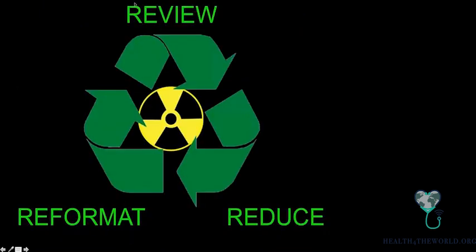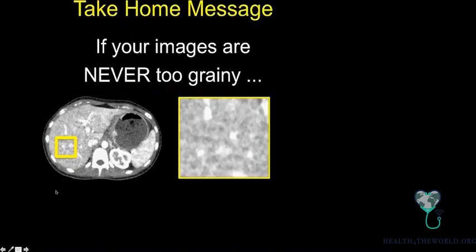Okay, so we've talked about understanding the dose, we've talked about lowering the dose, and then we've talked about taking low dose data and making it look better. The take-home message I will say again was, don't be afraid of seeing this. You kind of want to see a study that looks bad because you know you've pushed hard enough.